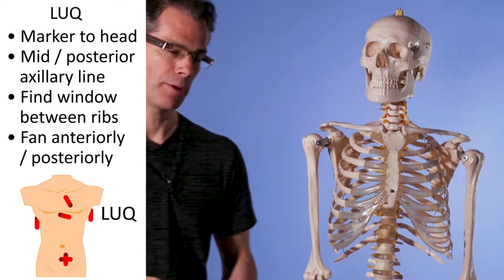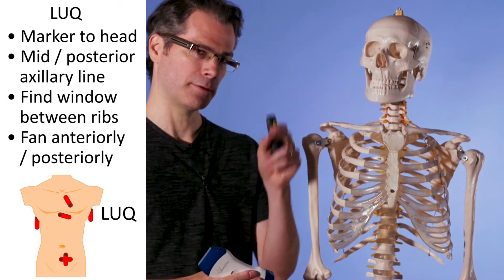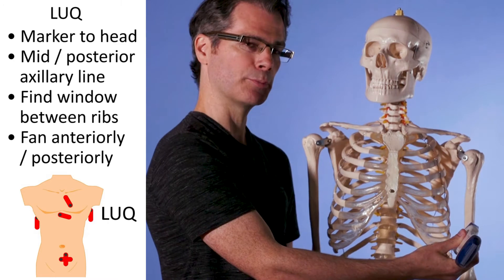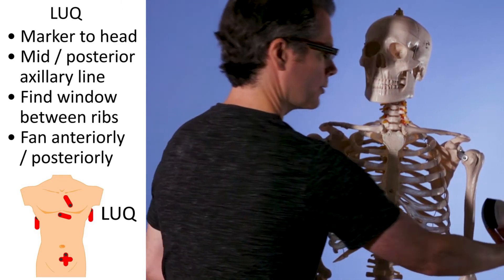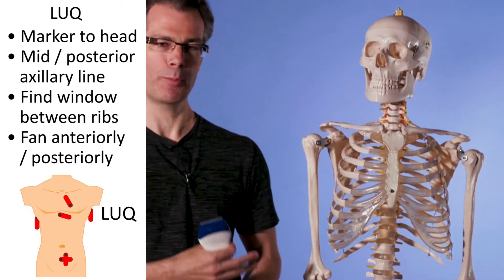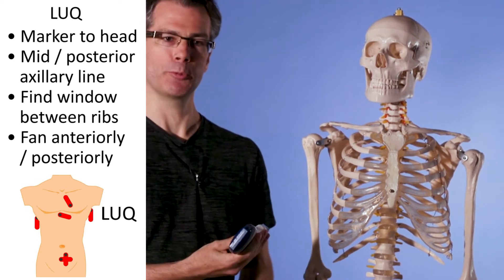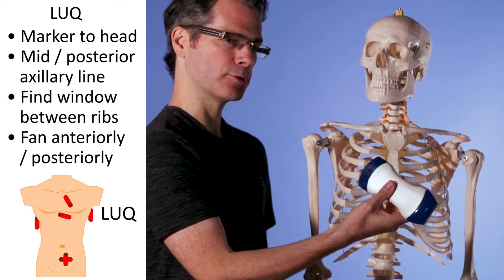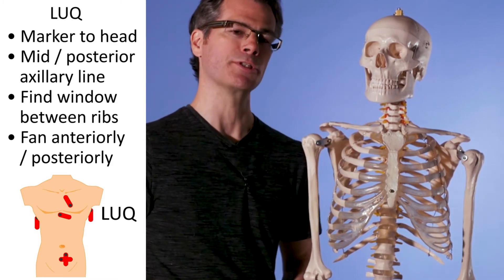Now we move on to the left upper quadrant. Again, have the probe marker towards the patient's head, but this time position a little bit more posterior and superior — so the probe is a little higher up and a little further back. Again, find a window between the ribs, rotating so you're a bit more parallel to the ribs. Once you've found your window, fan anteriorly and posteriorly, shining the beam all the way through the whole region.